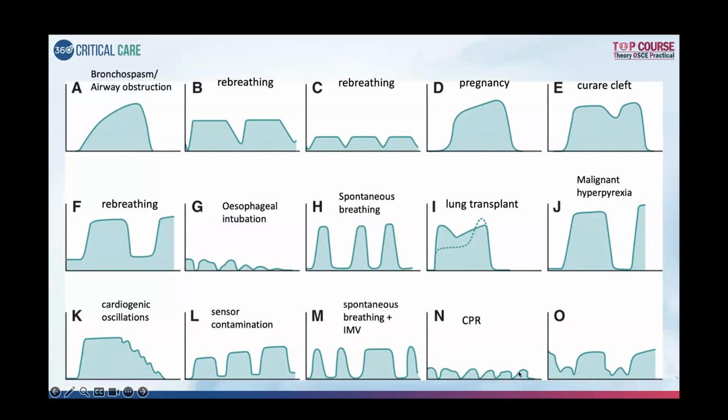CPR, as you can see, low volume, irregular. Yep, so that's CPR. And the last one is again rebreathing or spontaneous ventilation. You can see these are probably the mandatory breaths, but again it is not coming to the baseline, so it may be associated with some rebreathing.